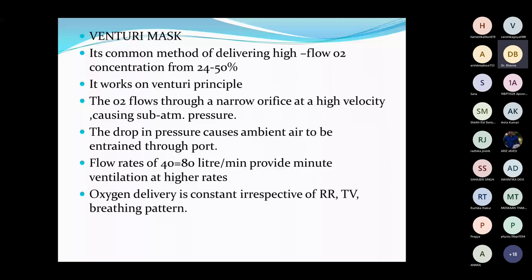So that means the patient is able to generate the FiO2 or the ventilation approximately double the amount of the oxygen given to the patient. So the oxygen delivery is constant irrespective of tidal volume and breathing pattern. Like I told you, the amount of oxygen is fixed in high flows, right? And the patient is able to generate the capacity to take the oxygen.